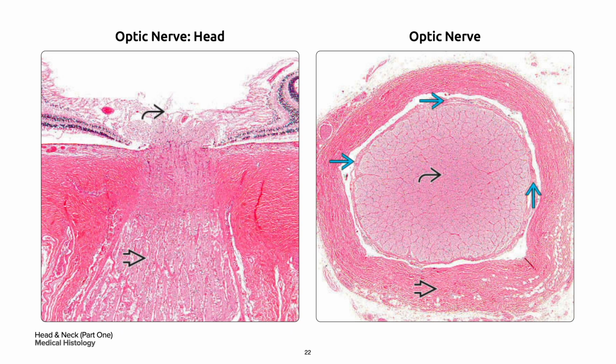On your left is the optic nerve. This structure pointed in bold black arrow exits the posterior aspect of the globe. Note the absence of nuclear layers of the retina overlying the most anterior aspect of the optic nerve in curved black arrow, leading to the presence of a physiologic blind spot.